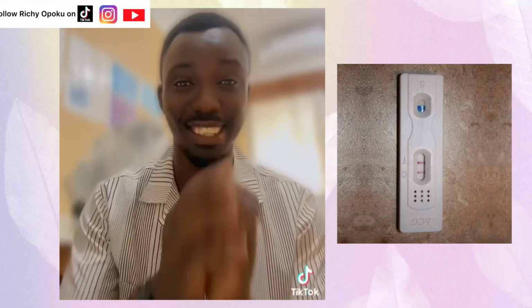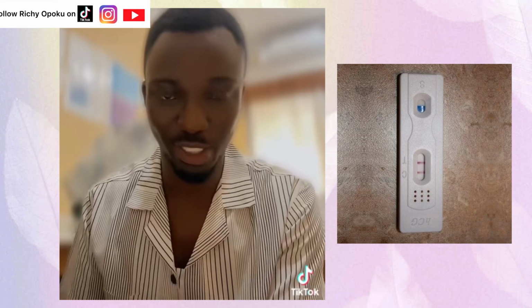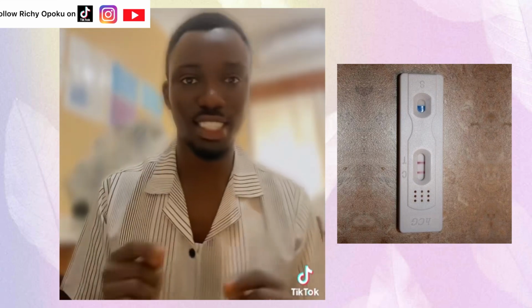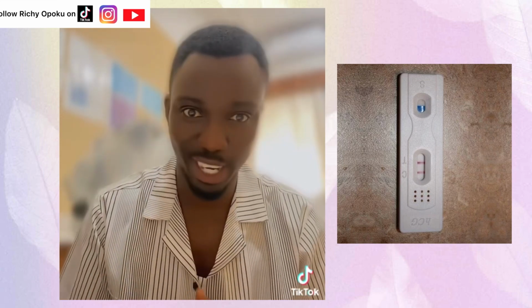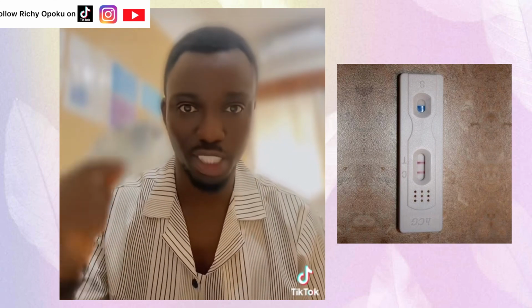Hi, I know most of you know how to do a pregnancy test in the house and how to read the results. It is very important that you know how to read the results correctly, because knowing how to test alone is not enough. You should be able to read correct results.